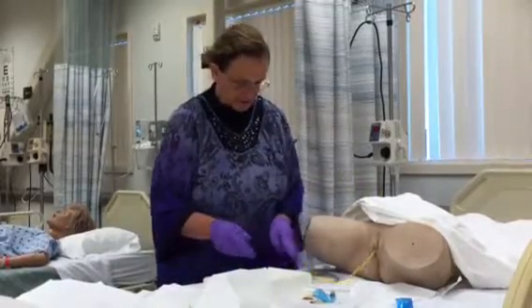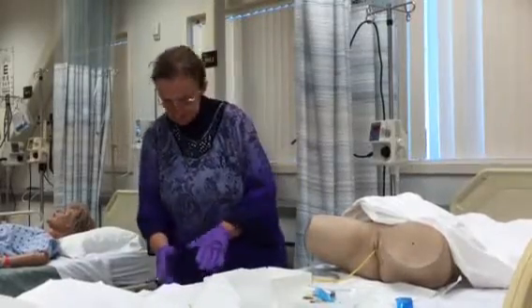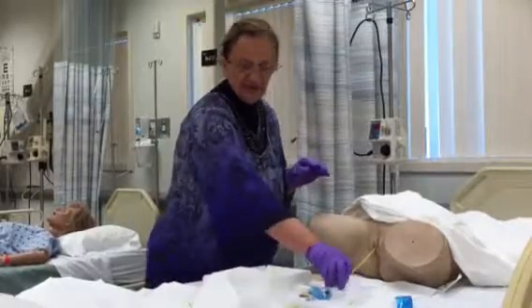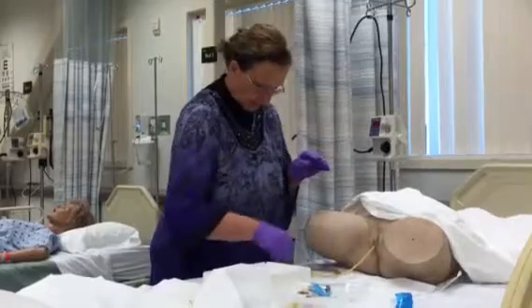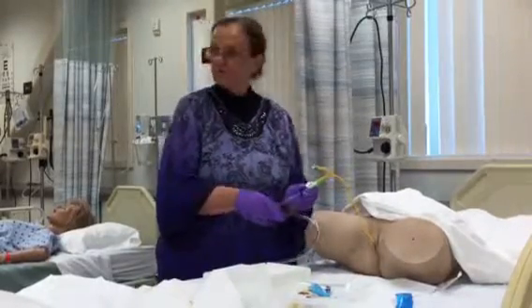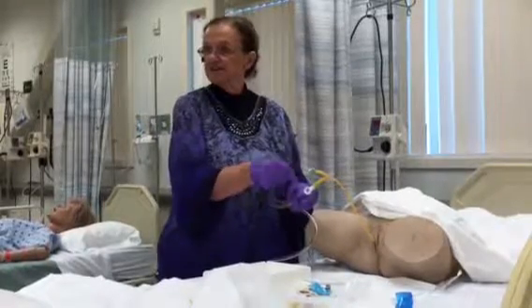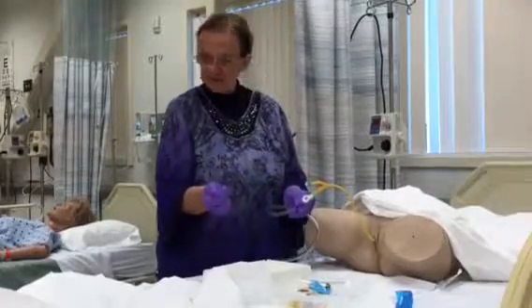Usually when we put a catheter in, we like to get the first urine specimen. I can get the urine specimen from the bag because the bag is sterile, and I would label it with time, date, initials, patient name, and all the proper labeling. If the catheter's already been in for a while and I need a urine specimen, I can get it out of this port by cleaning it with alcohol and pulling up with a syringe.